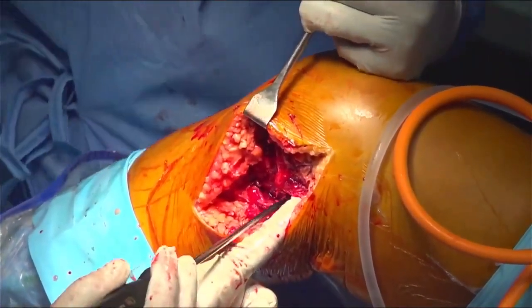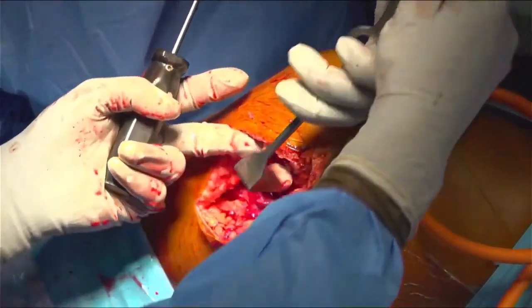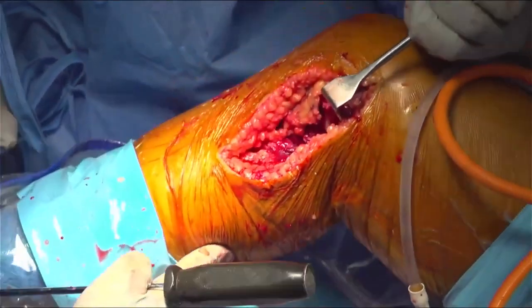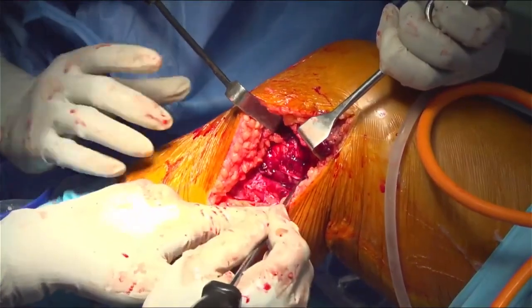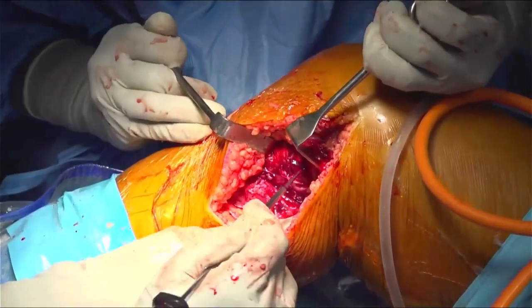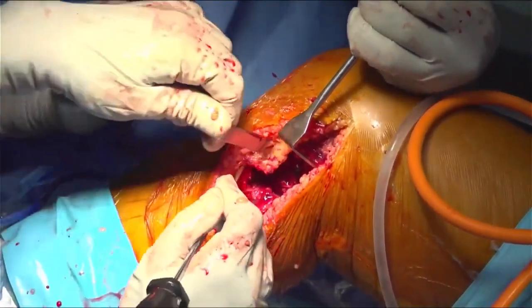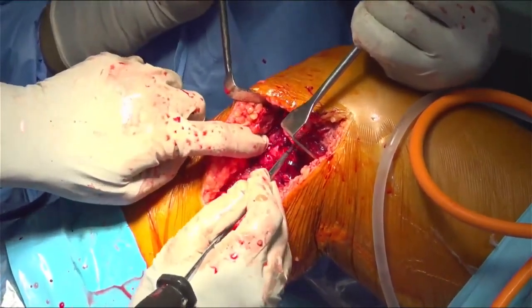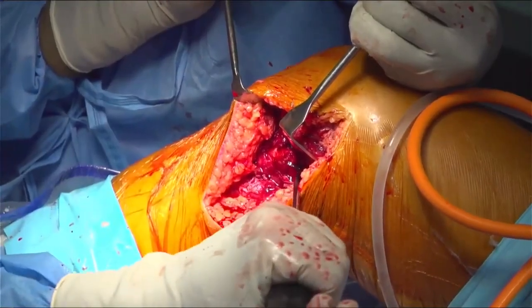This is the semitendinosus tendon. You can see there. Can you lift it here? So if you can see up here, this is the tibia which is totally exposed. This is the semitendinosus tendon which is seen here. This whole portion of the tibia and the meniscotibial ligament have been exposed, and we need to repair this to obtain a good result. So we will be doing a meniscotibial repair.